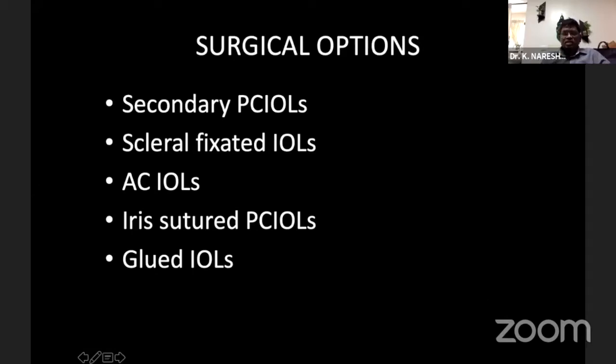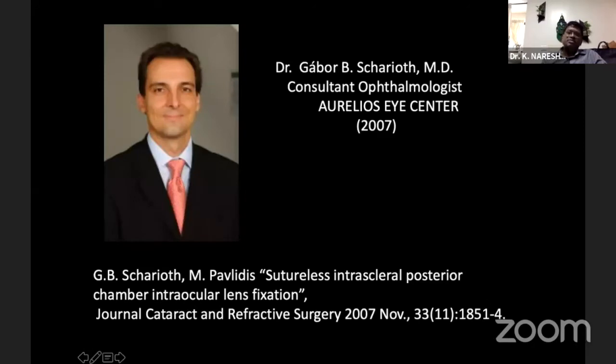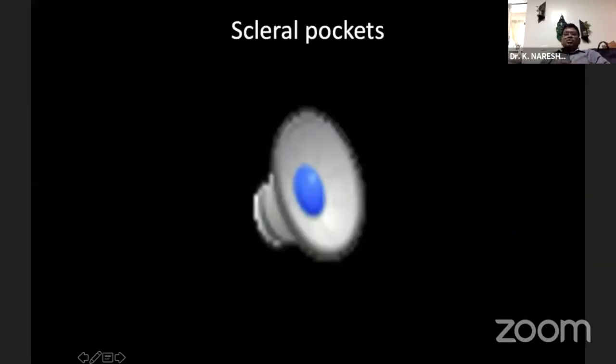I'll basically be talking about a no flap, no glue intrascleral IOL fixation, which was designed or told to us by Dr. Gabor Scharioth. I've always been a brand ambassador for Gabor Scharioth because he's one of the fantastic surgeons I have seen in my life, and I had the opportunity of meeting him personally and staying with him for close to 2 weeks. This is Dr. Gabor who first gave us this SF-IOL. The basic difference between the scleral fixated IOL and glued IOL is, except for the glue, the procedure is almost the same, but it will not be raising the flap.